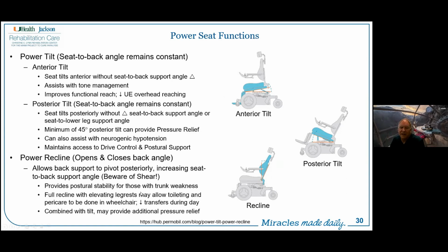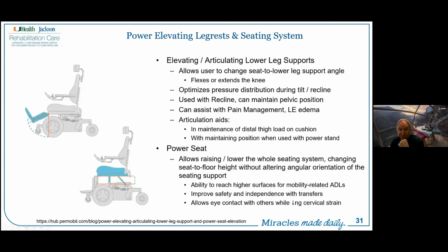The full recline with elevating leg rests, we'll talk about on the next slide, can help with toileting and peri-care, the perineal space in a wheelchair. Also reduces the need for transfers during the day. Combined with tilts, this can provide additional pressure relief.